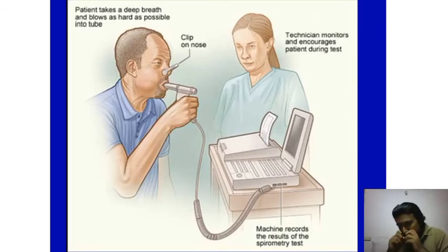We don't waste even the smallest amount of the gas, which we generally use for exhaling as well as inhaling through the nose. So that's the clip. That's why the clip, right? And the patient generally will be asked to take a deep breath, and this is one test.